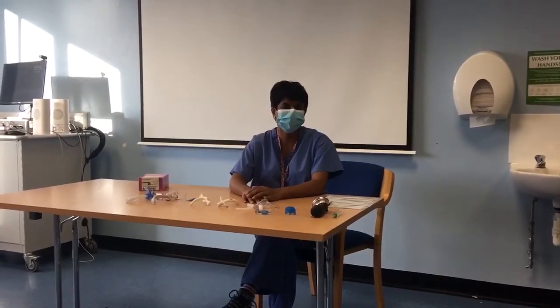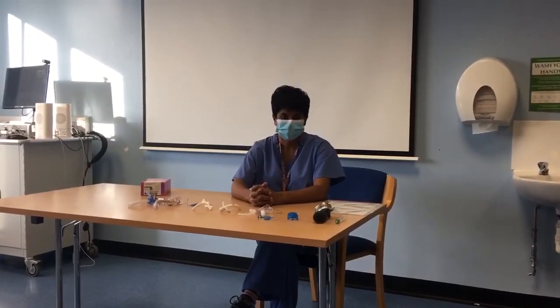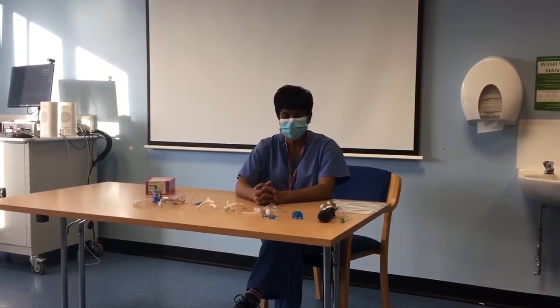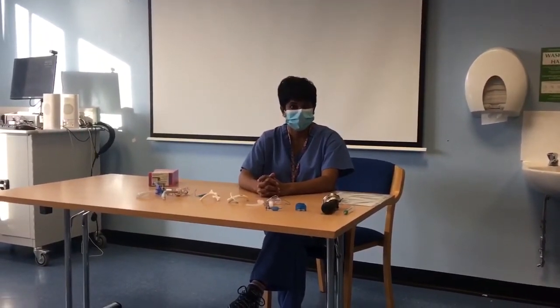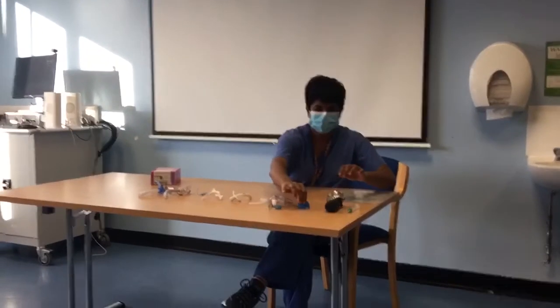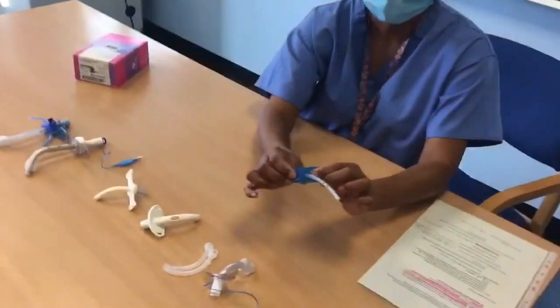I'm one of the clinical educators who works on the tracheostomy and laryngectomy day, and I'm going to walk you through some of the tracheostomy tubes that you will see in NHS Lothian. So to start off with, we'll start with a smaller one, and that is your mini track.